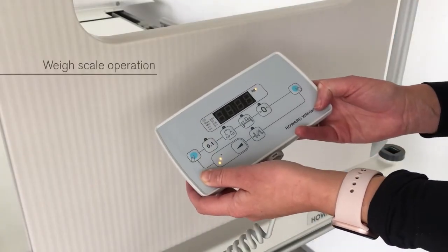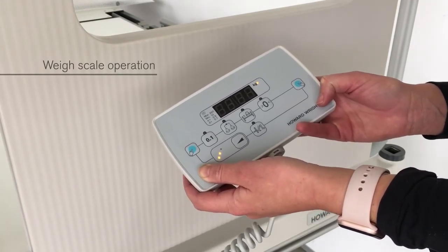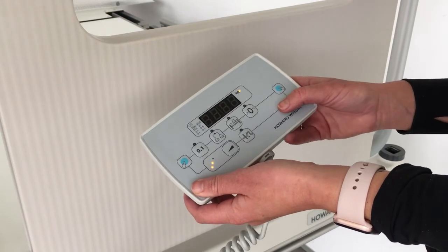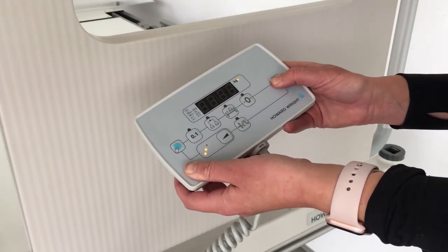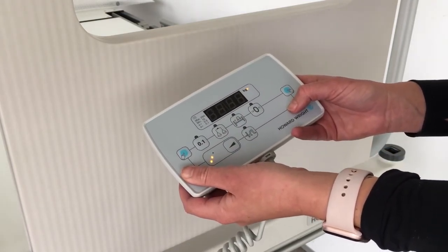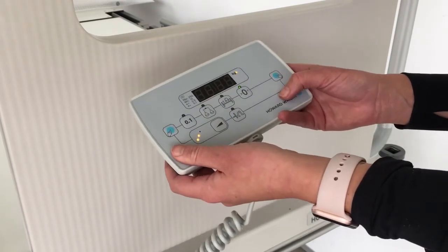A weigh scale is available as a factory fitted accessory and if fitted has a scale control at the foot end of the bed. The scale control has two operation buttons together with several function buttons. To operate any scale function, an operation button must first be pressed and held while a function button is being pressed. To zero the scale, there must be no patient on the bed. Press the zero function button to set the display to zero.